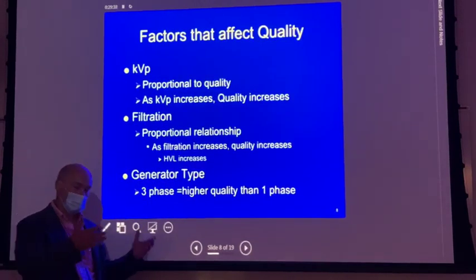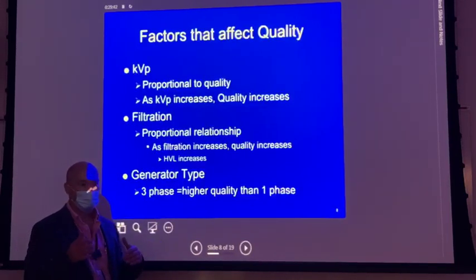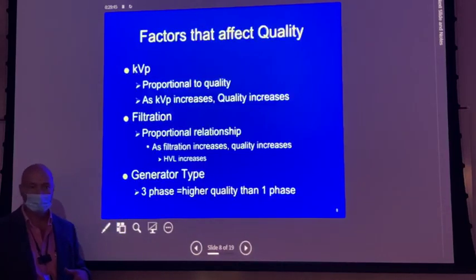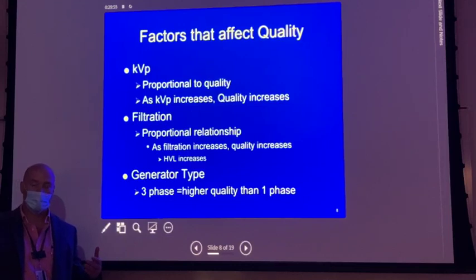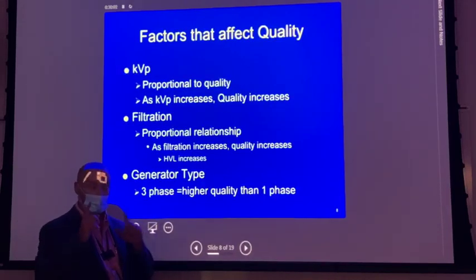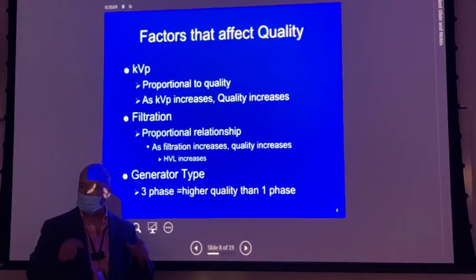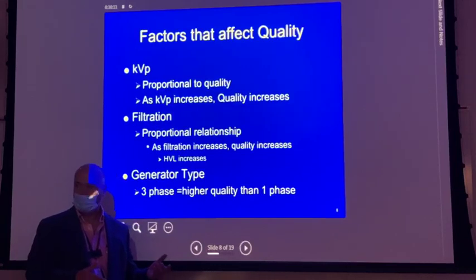So every year he's got to come in and run those tests, and he's got to make sure that the exposure that you make is representative of the settings that you set. So he's got to read the quantity and quality as it comes out of the x-ray tube. As the tanning goes up, you get more absorption in the x-ray beam. So what is he going to have to do? Go up on the technique. Your technique as you read it remains the same, but he's going to have to tweak the machine and make it shoot with the same mAs value that it shot with before, right?